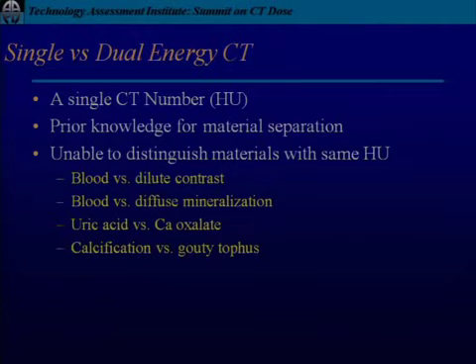So I've been using a dual energy scanner for almost 2 years, on the dual source scanner that we have. GE has also introduced a new scanner called Discovery, which has dual energy capabilities. And I find that there are applications where dual energy can actually help you a lot.